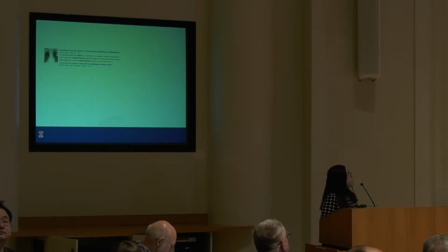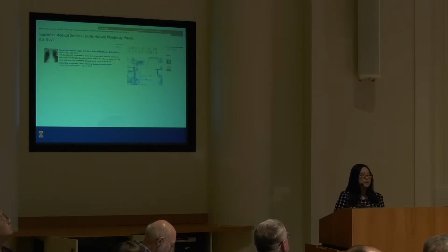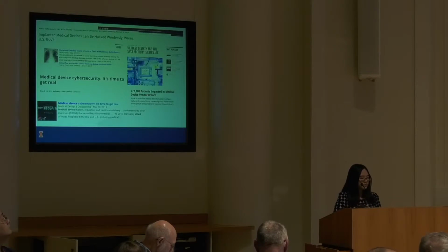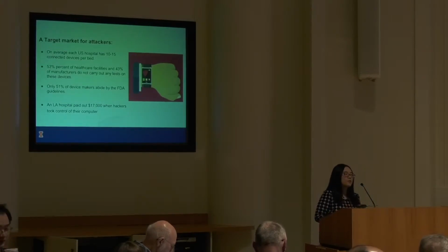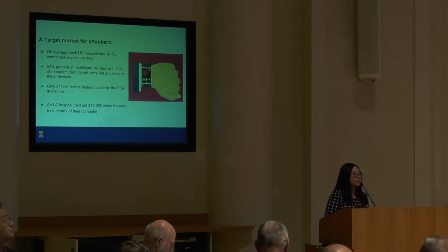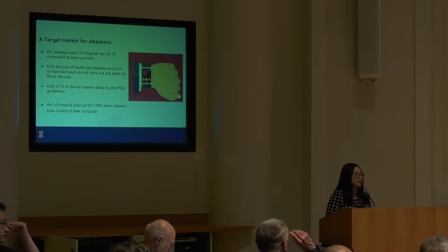However, coming together with the great convenience is great risk. There have been a lot of critical flaws identified in medical devices, and some of these attacks can even be carried out remotely without access to the device. Moreover, medical devices have also been a target market for attackers for several reasons. First, medical devices have a large attack surface. On average, each US hospital has 10 to 15 connected devices per bed. Counting hundreds of beds per hospital, this results in a lot of vulnerable medical devices that can potentially be attacked.